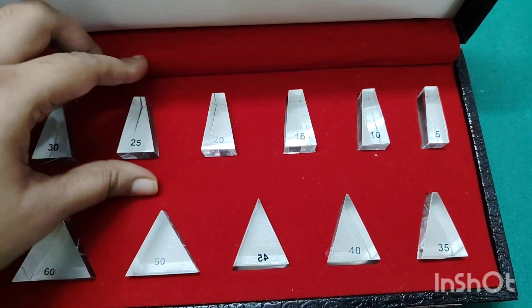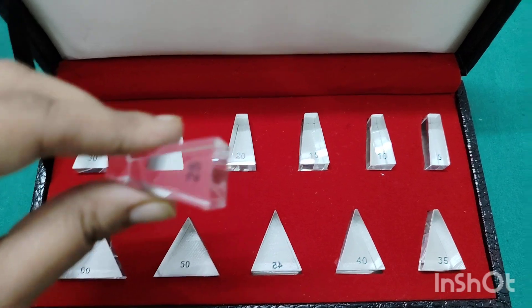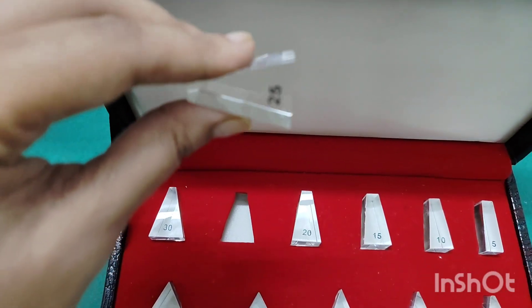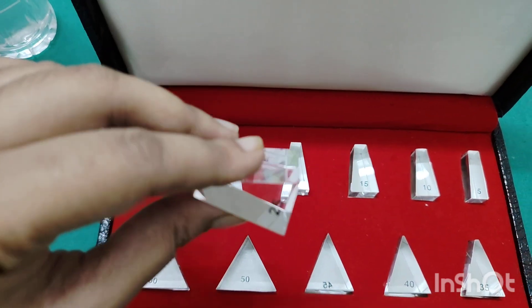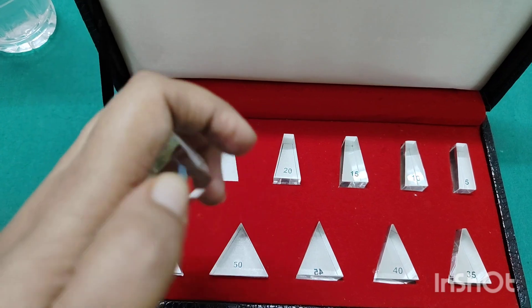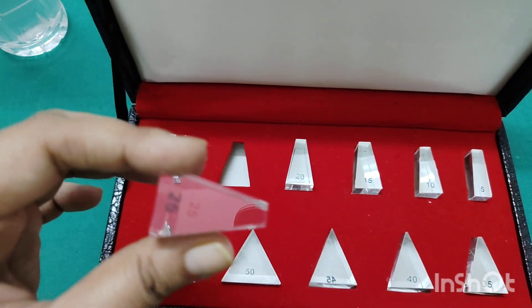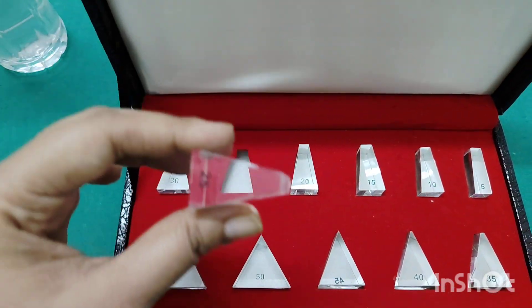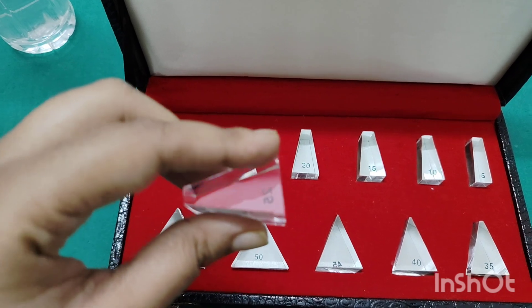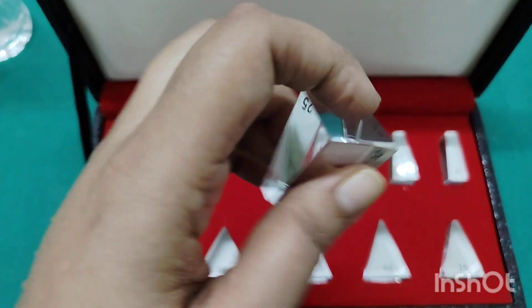These prisms are used for squint evaluation. For exotropia, you place the prism in the base-in position. You give the patient a target at 40 centimeters and perform an alternate cover test — this is the base-out position — to measure the amount of esotropia, the horizontal squint. The patient holds the target at 40 centimeters while you perform the alternate cover test with this prism.